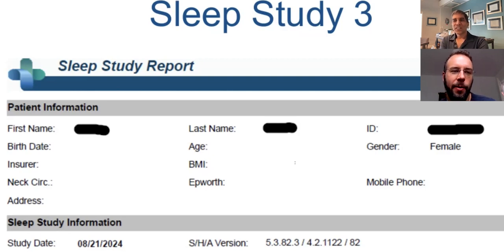Yeah, I did one. It was really boring and tedious, but I was kind of thinking similarly along the lines that you're thinking. If people really want an answer about their WatchPAT, they can go to that video, but it kind of failed as a video. But this is different. I think the variance between the studies is a super important component that I wasn't able to present. I basically presented the poster that they give you on their website. Hopefully what'll happen is people will resonate and say, hey, that's me, that's mine, or they'll pull out their WatchPAT.